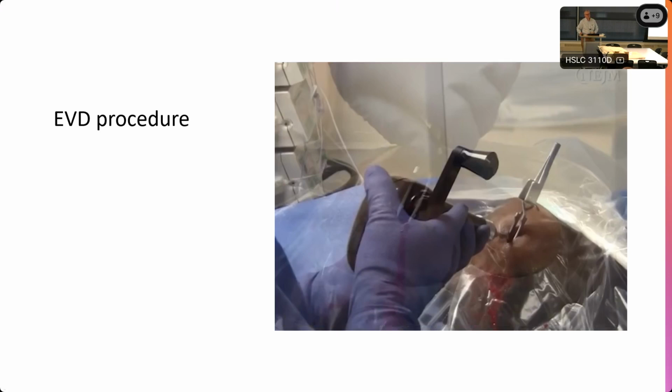But if you go past the depth, you're just making a slightly larger hole, right? So we're already going to poke a hole. Which is one-stop shopping. Yeah, you go to the garage, you're done. So I don't feel that strongly about having a depth stop. Of course, the drill shouldn't be extensively long.